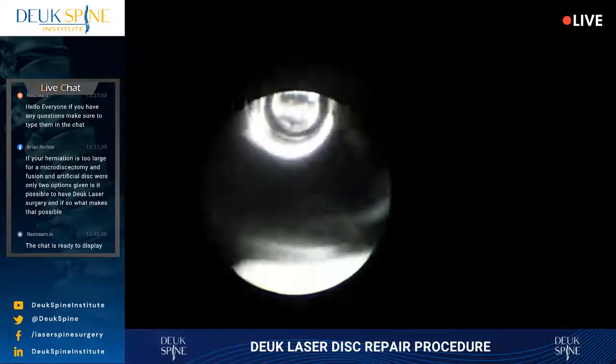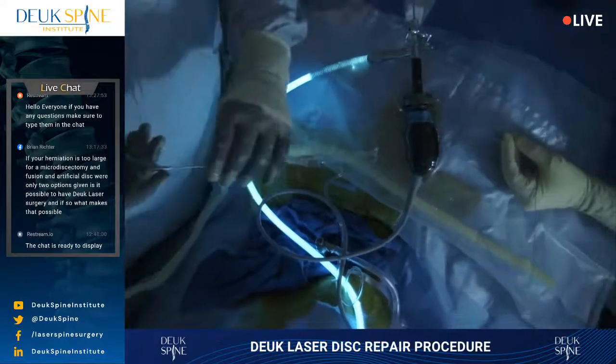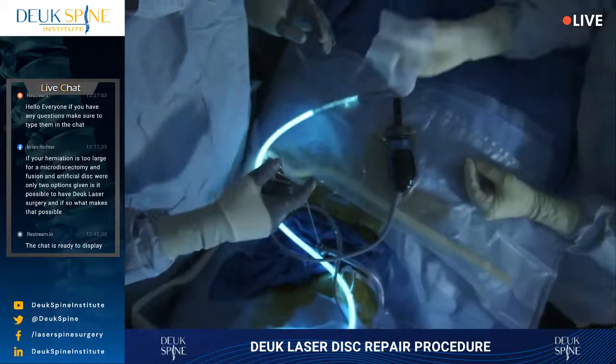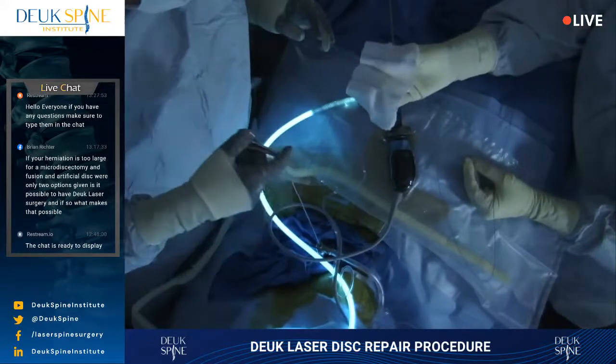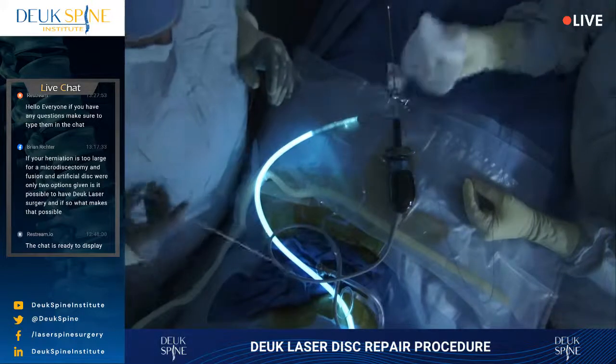That's a herniation. Now notice I'm in the back of the disc, literally the back 5 millimeters, maybe a couple of millimeters of the disc, and I am pulling out the herniation. Oh, I felt it come. It must have fallen off.